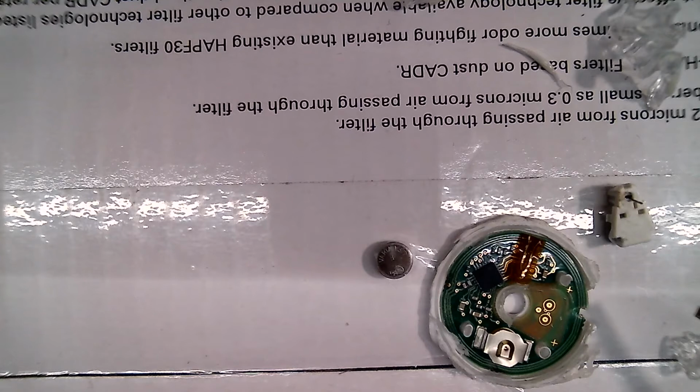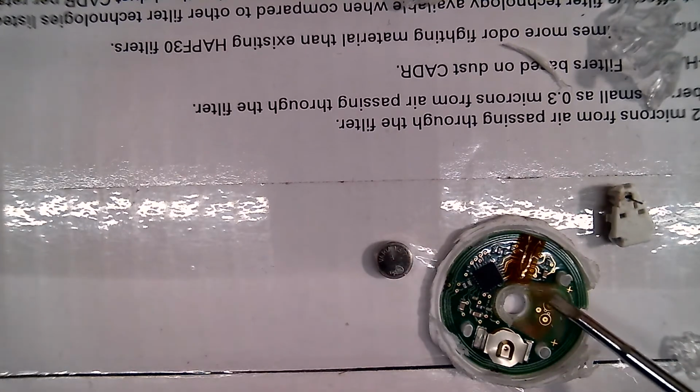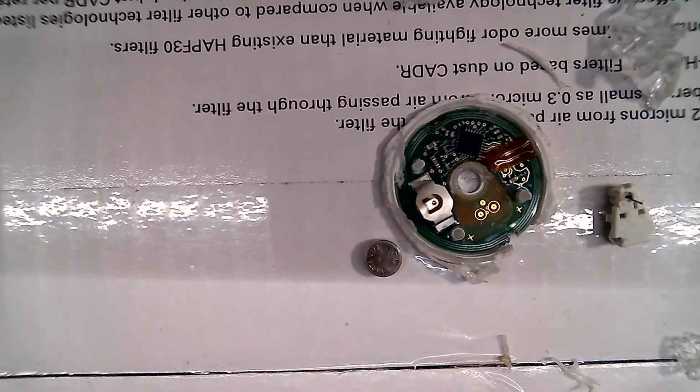So, wow, and it's probably horribly angry too. Well, I've taken it apart. Obviously, it's going to think it's been disassembled. And actually, you can see plus, minus, plus. Not much else on there, though. Let's see if we can pry it out and see if there's anything on the back. It's very stuck in here, though. Oh, come on. Damn it. Not a lot on the back. We can get it out of there. There we go. Okay, got it.